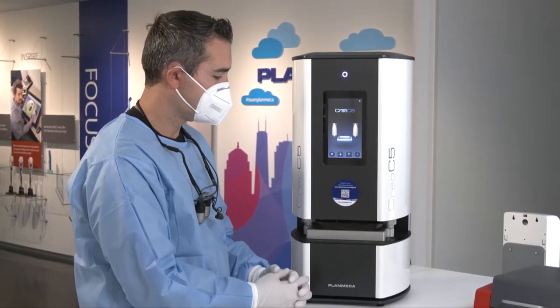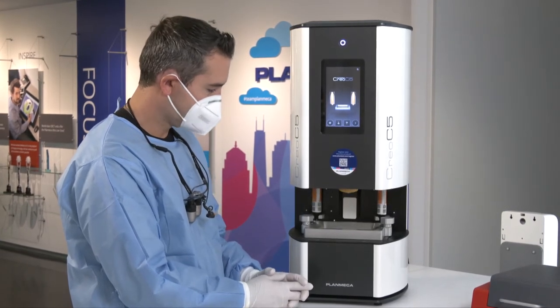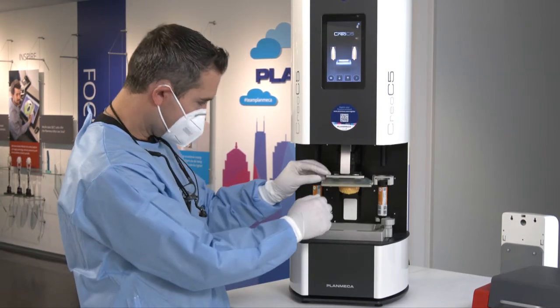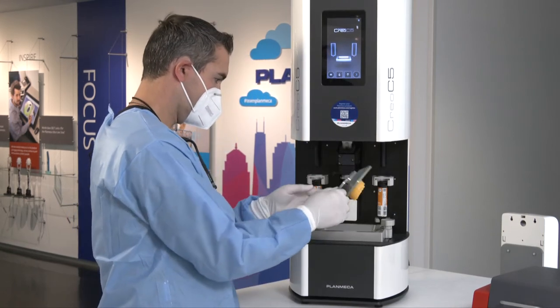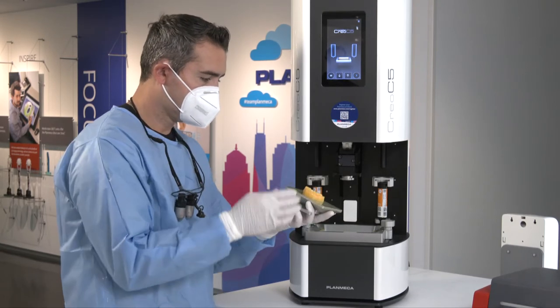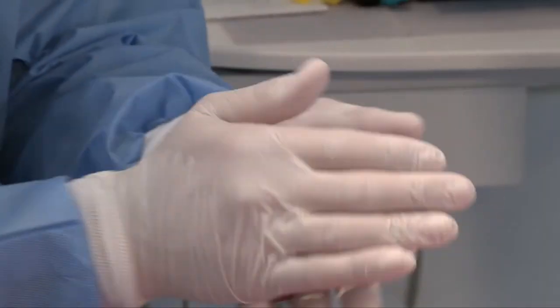So here I am. Now, I decided to print the one that I did in PlanCAD Easy because, to be honest with you, that's what I do for most of my patients, unless I'm doing full mouth reconstruction or hybrid prosthetic or something like that. So here I am on the Creo C5, and we're gonna pop this sucker off and go ahead and put it in some alcohol, clean it up, and we're gonna go ahead and make a putty wash of it. Really, really cool. The detail that this thing prints in is amazing.